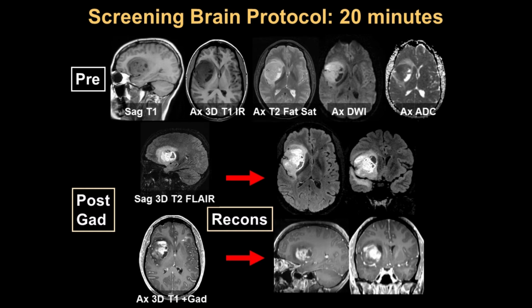Now, we have a lot of options for imaging, obviously. Depending on the circumstance, we may start with CT, and that's perfectly adequate, particularly for new seizures in a large number of cases. But if we have the ability to obtain MR, and particularly when we have refractory epilepsy patients, we're going to go on to MRI and have a strong preference for that over CT. And furthermore, if we have it, we'll want to use high field systems like a 3T scanner, if possible, to get the best possible exams. Again, it really pays off. If we can find the substrate for their epilepsy, we may be able to offer them a cure.